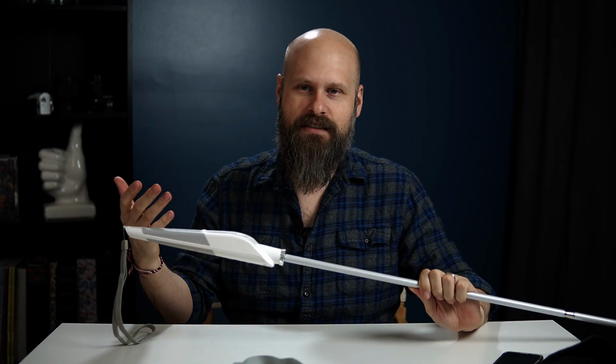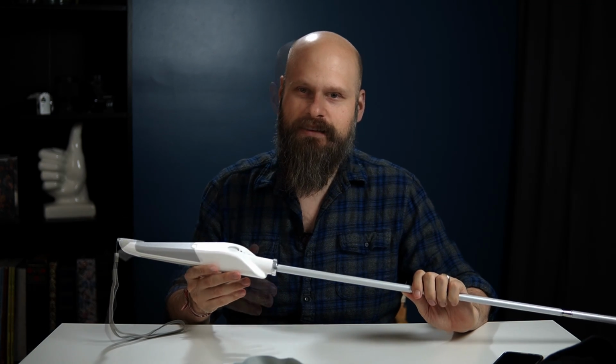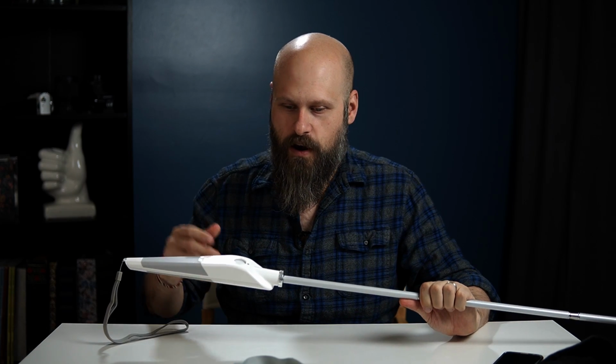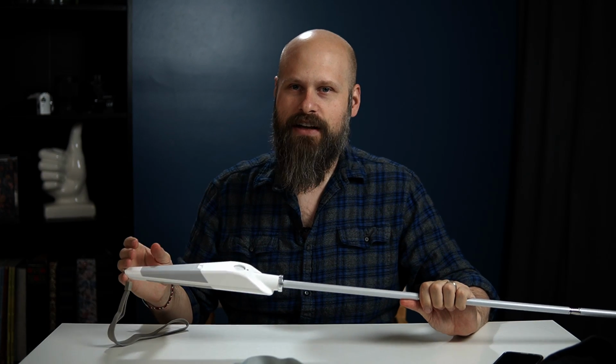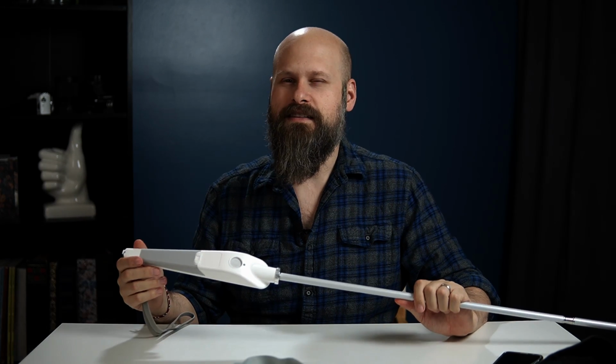I like to play devil's advocate in these videos, so I'm not going to say, yeah, it's awesome, run out and buy it. I want to try and point out the pros and the cons for the device. So, obstacle detection, it's got the built-in navigation, you can find your phone, you can turn on the little LED light. There's lots of really cool things that it does, but one could argue that most of those things, especially the navigation, you're carrying around your smartphone anyway, so you could just use the navigation on the phone instead. It does keep it hands-free, you don't have to pull your phone out, you can just do it all from the cane, so that's nice.